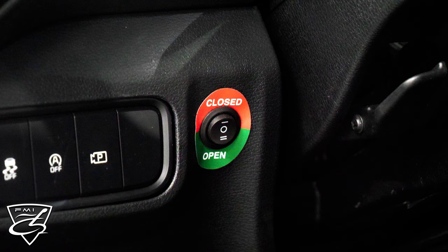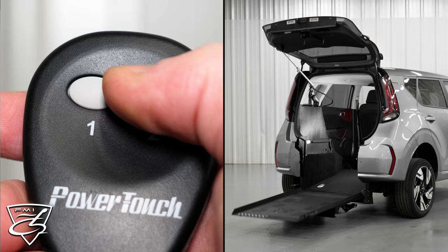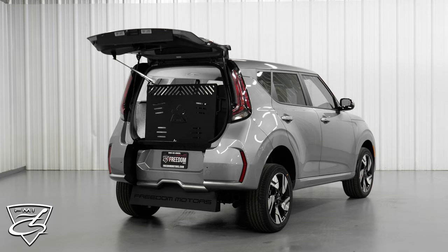One other really cool feature I'd like to point out — we mount a dash-on switch right here, which makes the ramp deploy by the simple push of a button right from the driver position. So you don't always have to use the remote; you can also use the dash-on switch. Now we're going to go ahead and close up the ramp and the hatch by the simple press of a button — push and hold button two, and everything closes up for you.